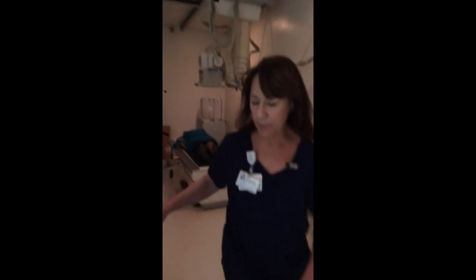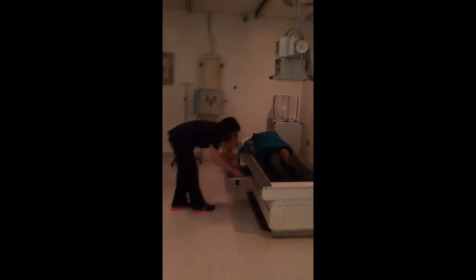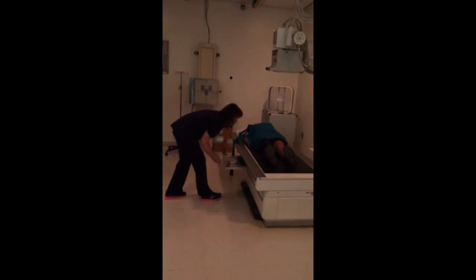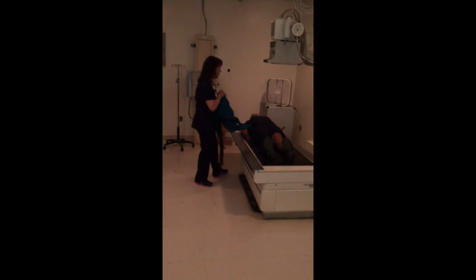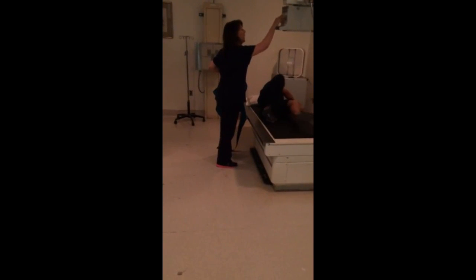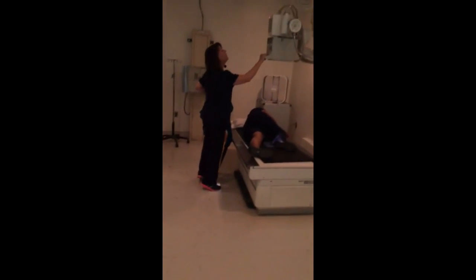I'm going to set my IP down, grab a new cassette, insert it. Okay, this time I need you to roll over towards the wall, that direction. My tube tilt will be between 5 to 7 degrees in angle.